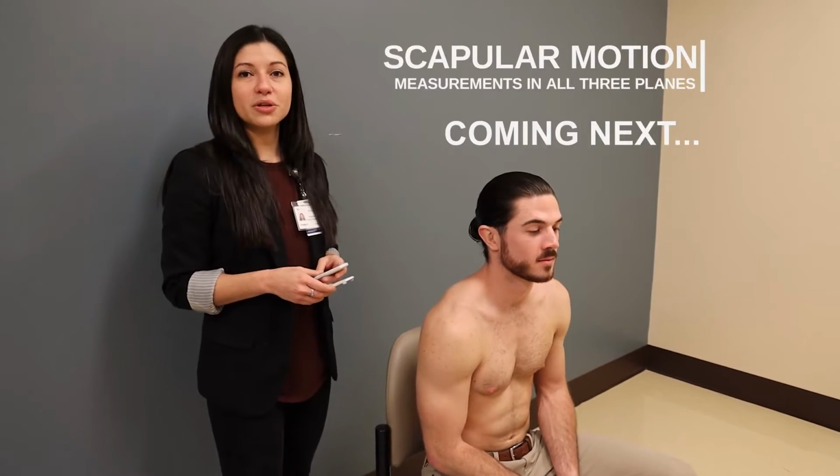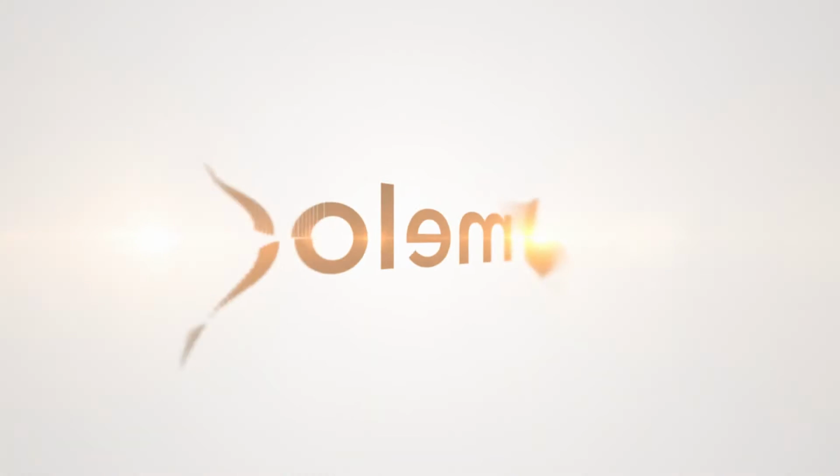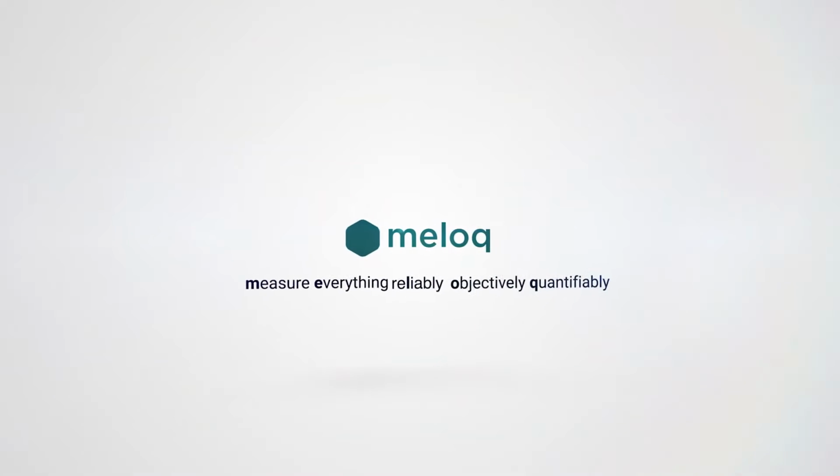So I'll be showing you guys today how to measure scapular motion using the EasyAngle. The scapula moves in three different planes, the first one being the scapular plane, and that's for upward downward rotation. The second plane is the sagittal plane. That's when the scapula moves into anterior posterior tilt. And the third one is the transverse plane, and that's when the scapula is moving into internal and external rotation.